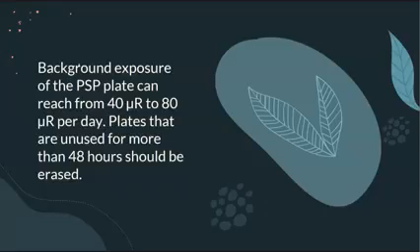Like I said kanina, before you start imaging patients, you have to erase it, okay, prior. Whenever the condition of a cassette is in question at all, it should be erased. So, if you are unsure of the contents of the cassette, kung ilang araw na ba siya wala nagamit or kung nagamit ba siya, it is proper practice to erase it before again exposing the cassette, okay, or the PSP plate po.